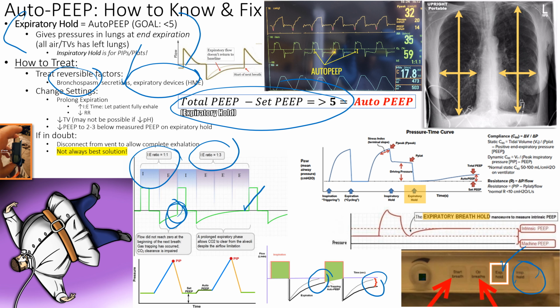The tidal volume can be decreased, so it's much harder to air trap with 200 than 400 cc's, for instance. 200 is a little bit low, maybe 250, 300. All right, and then PEEP can be reduced, so instead of going all the way up here with air trapping, let's bring it down a little bit. Let's bring the PEEP down some.